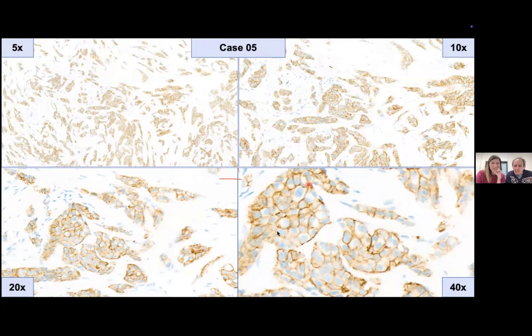Okay, very good. So it's between 3+ and 2+. Okay, let's see if I can make it 3+. Actually, the 3+ needs to be seen here at times 5, okay? Hand on heart, I can see the membrane staining at times 5. Indeed, at 5. I agree.